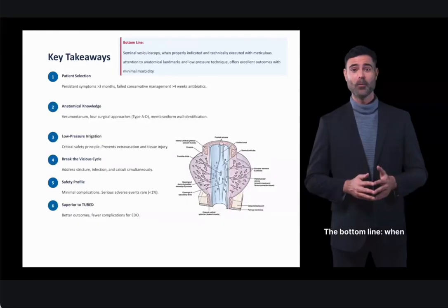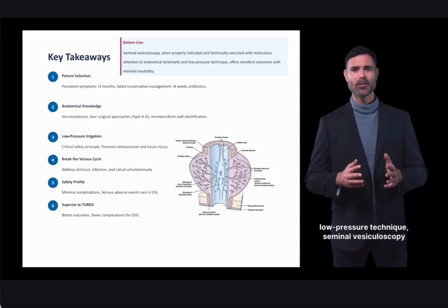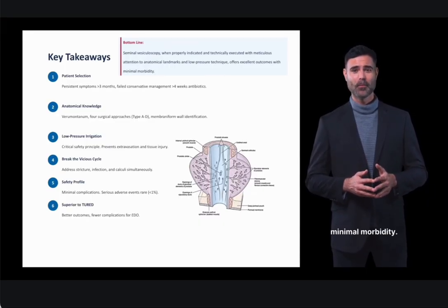The bottom line: when properly indicated and technically executed with meticulous attention to anatomical landmarks and low-pressure technique, seminal vesiculoscopy offers excellent outcomes with minimal morbidity.